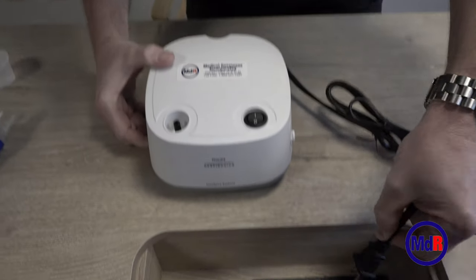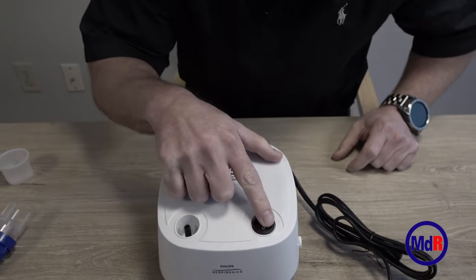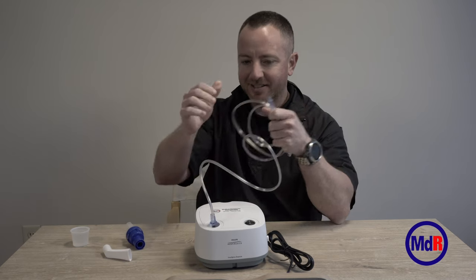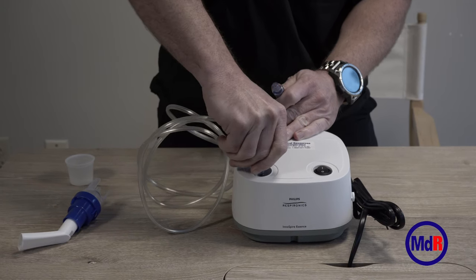This is an electric machine, so it has to be plugged into the outlet to work. On the front of the machine you should have an on and off switch. The next piece is the tubing that connects to the top of the machine — just wiggle it and push it on. It doesn't matter which end of the tubing you use.